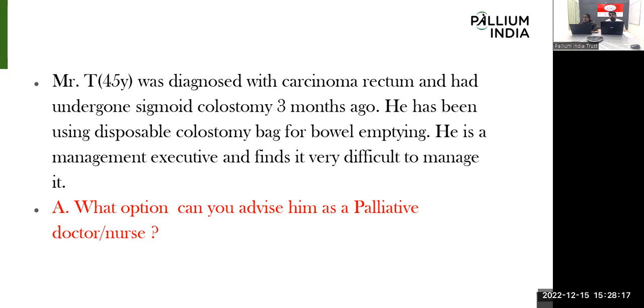You can check any changes in the size of the bag. Her bag size is also all set. Here the main complaint is that when the bowel is moved, the fecal matter comes out, and that fecal matter is collected by a colostomy bag. When the colostomy bag is filled, he needs to go to the toilet and discard the fecal matter or change the colostomy bag. That is quite difficult for him because he is working as a management executive.